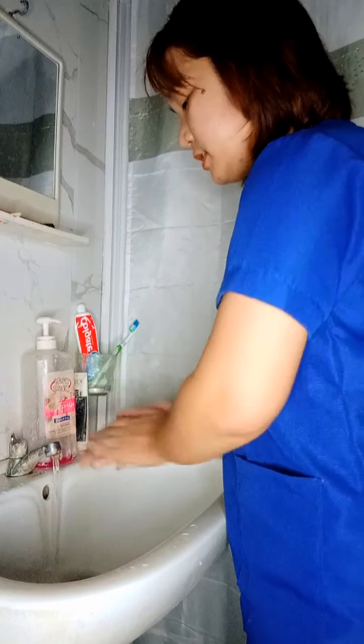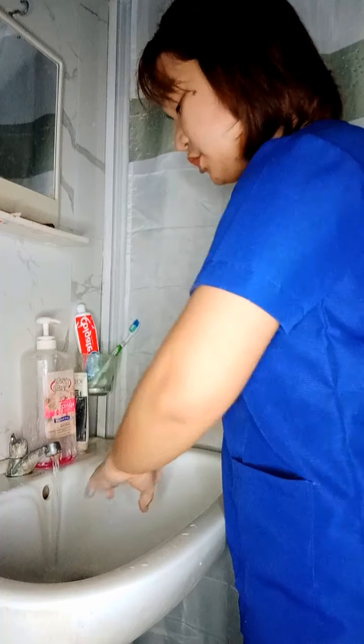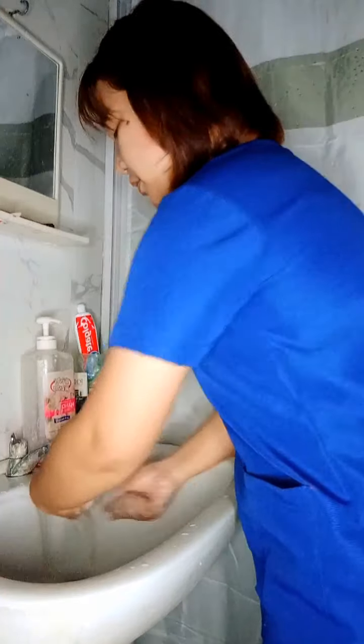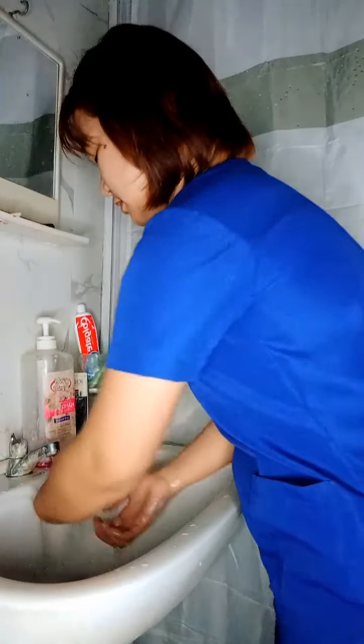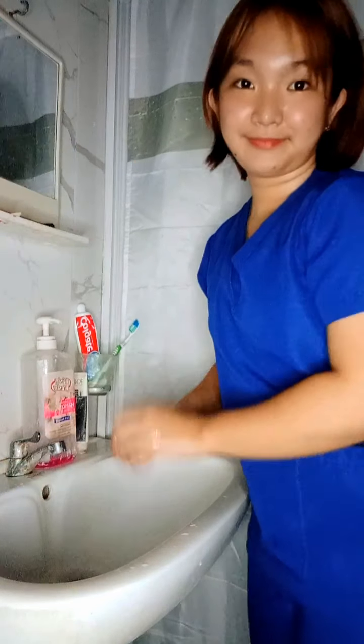The first step in procedure is to wash hands and observe other infection control, like wearing gloves. After washing your hands, you can now wear gloves. As you can observe, I'm now wearing surgical gloves; any sterile gloves will do. The second step for procedure is to prepare the medication ampule or vial.